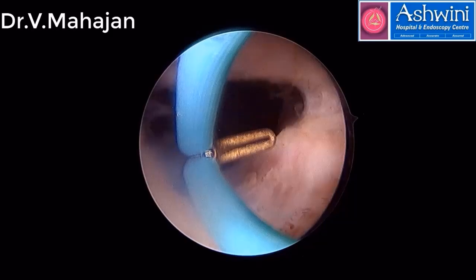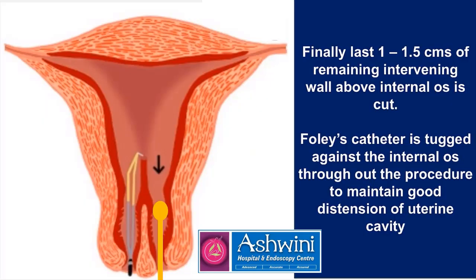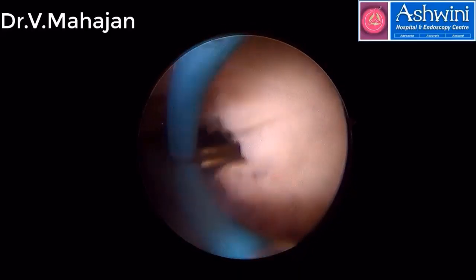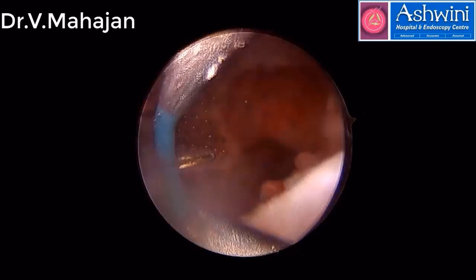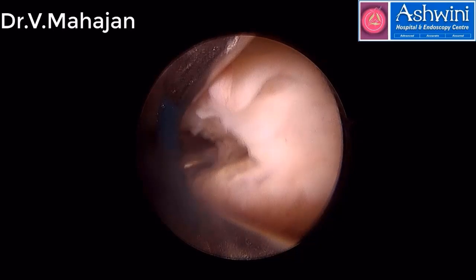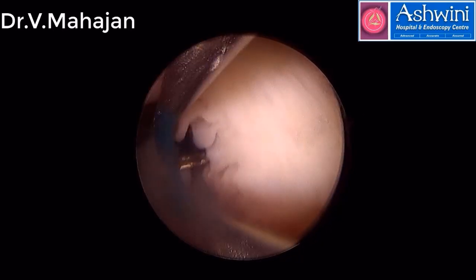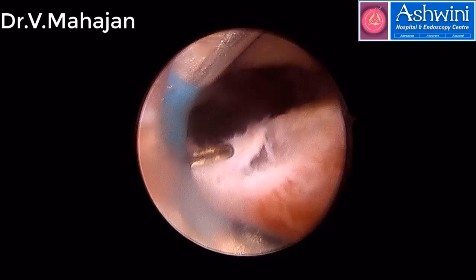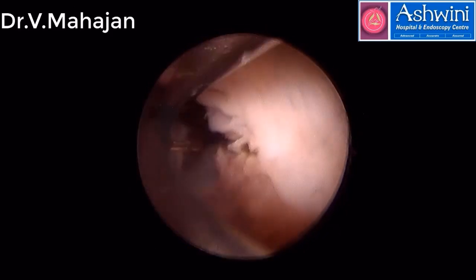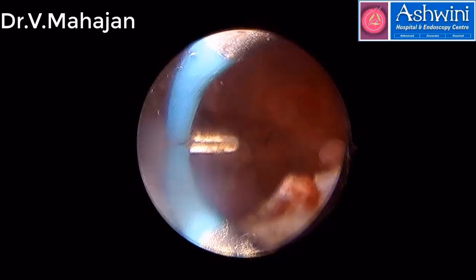Now, this is very important. Finally, the last 1 to 1.5 centimeters of remaining intervening wall above the internal os is cut. The Foley's catheter is stuck against the internal os to maintain the distension. So I am cutting the proximal part of the septum, which is near the internal os. Now how do you know you are near the internal os? First, you can visualize the internal os. Secondly, from the opening you should be able to see the contralateral, that is the left cavity, lateral wall. If you see that properly, that means you are done. This is the lateral wall, and I am able to see it properly.